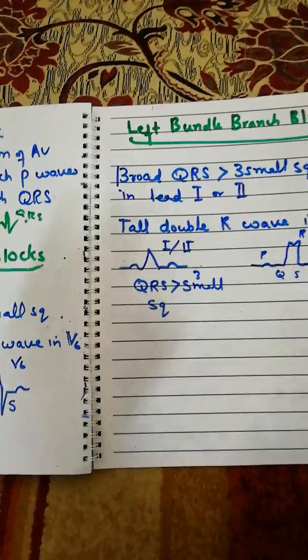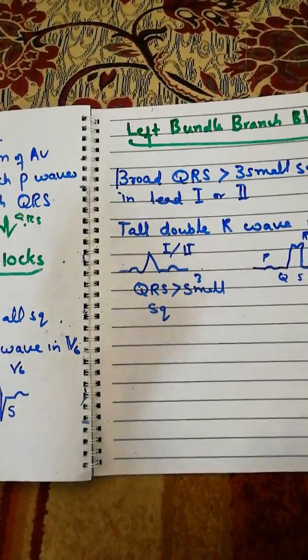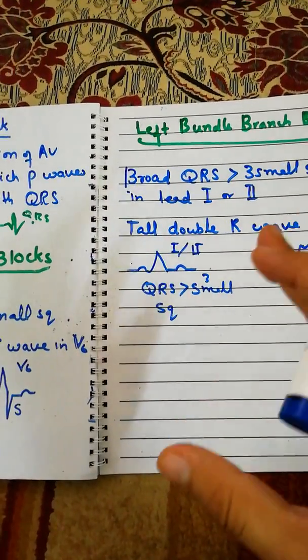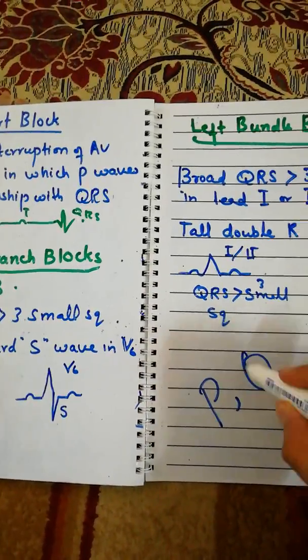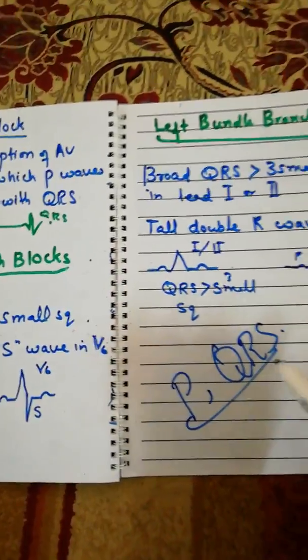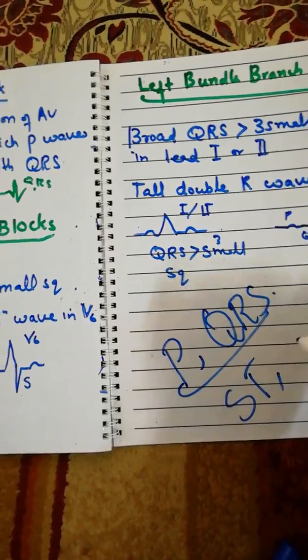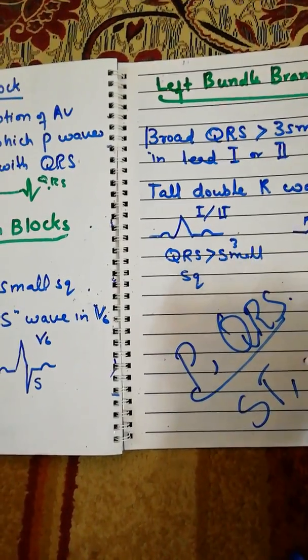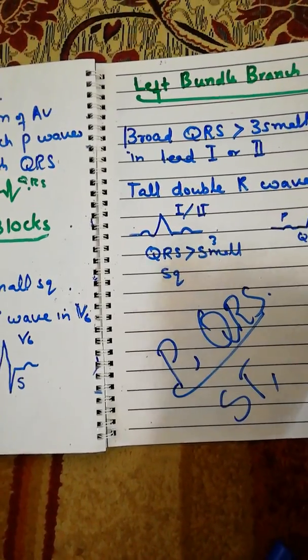I tried my best to cover as much as possible in a single lecture. So this was all that I have covered up to now. I have covered the P wave and its pathology and approximately the QRS. After this, in the coming lecture, I will explain the ST segment and the remaining pathological conditions like arrhythmias and their interpretation on ECG.